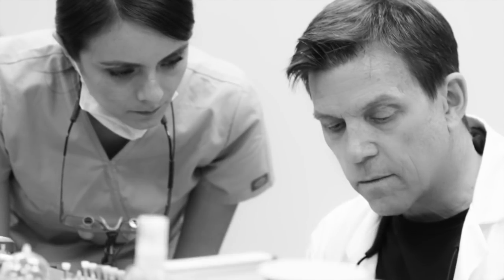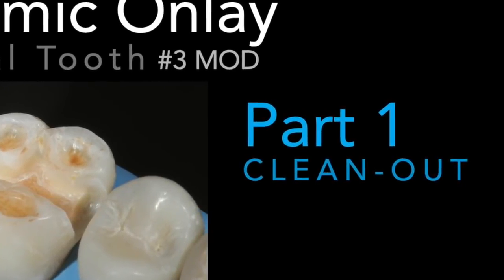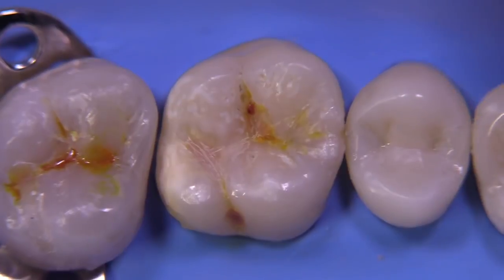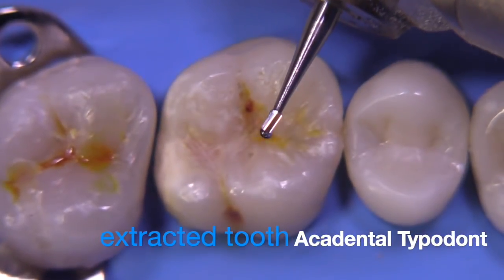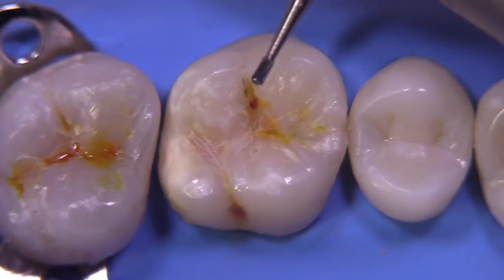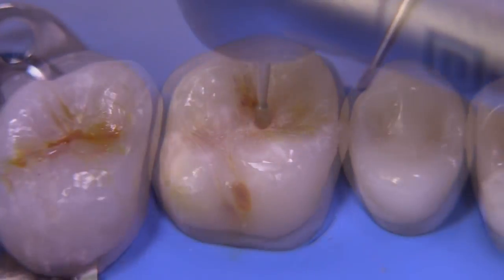I'm going to start with part one, which is the clean-out step and the considerations for when we would onlay versus when we would just continue with perhaps a direct composite. We have an extracted tooth mounted in an Acadental typodont, and I'm going to start with a 330 carbide and start the outline, which is going to be an MOD based on the caries findings in the tooth.